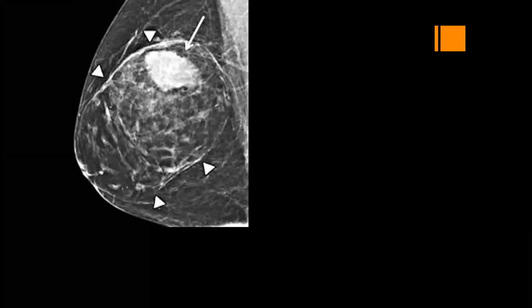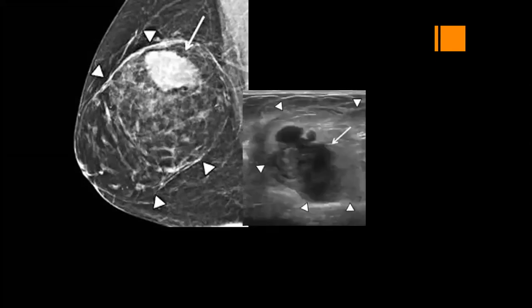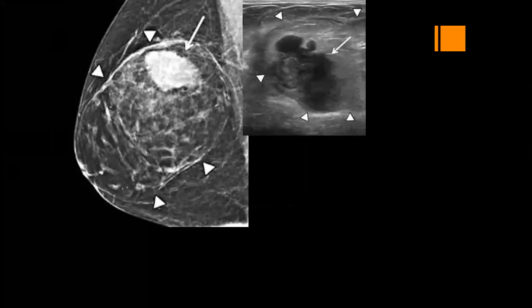Malignant transformation is rare. Hamartoma is normal breast tissue in abnormal locations, so a malignancy can develop within it. Yes, because it contains fat, fibroglandular and stromal, the same three components of the breast, you'll find within a hamartoma.